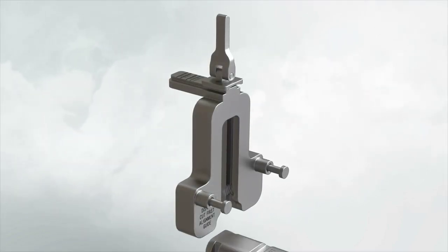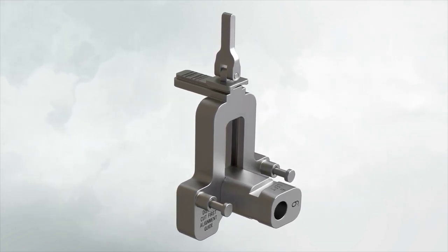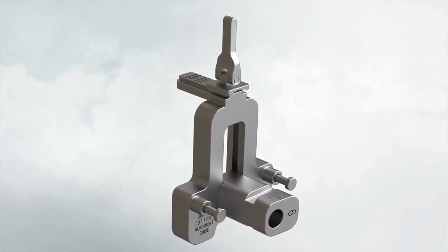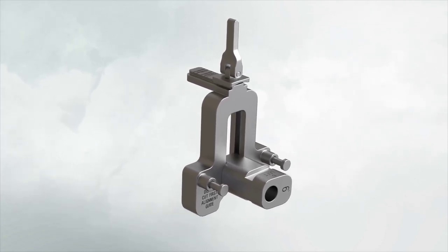Attach the selected valgus angle bushing — 5 degrees, 6 or 7 degrees — to the valgus alignment guide. Check the bushing position to make sure that left is facing anteriorly when operating on the left knee, and right is facing anteriorly when operating on a right knee.